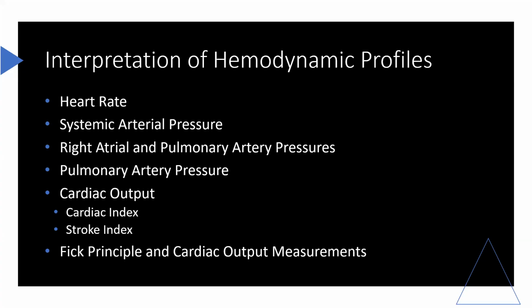The mode of mechanical ventilation used can also significantly affect measured hemodynamic parameters. It has been shown that the lower mean inspiratory pressures present with IMV and PSV minimize the hemodynamic effects of positive intrathoracic pressure and help maintain right heart preload and cardiac output. Pressure-controlled ventilation has about the same effect on hemodynamic values as does volume-controlled ventilation. However, pressure-controlled inverse ratio ventilation decreases cardiac index and thus oxygen delivery.